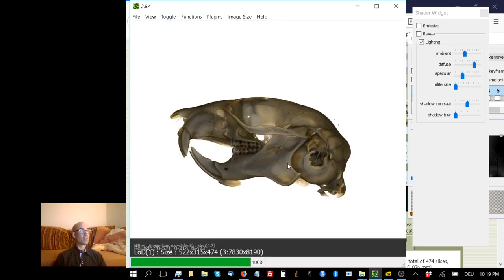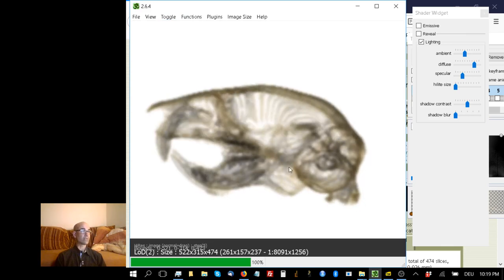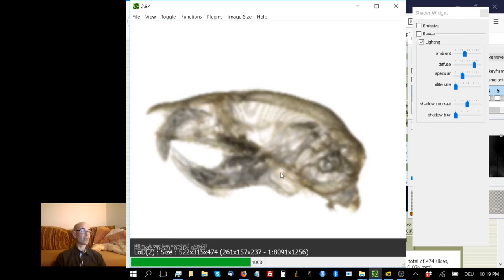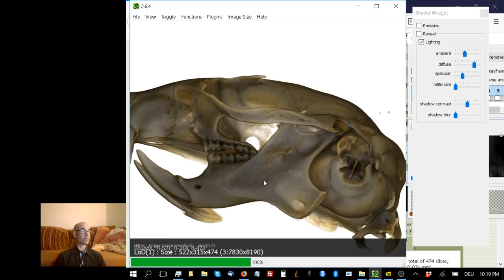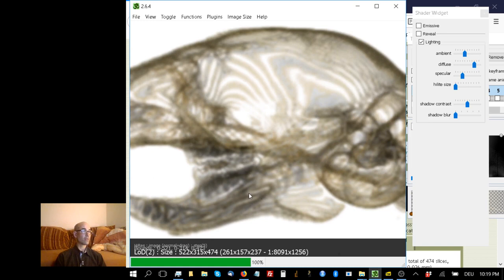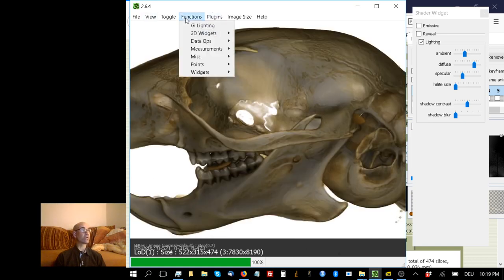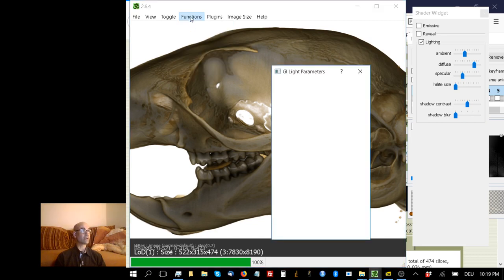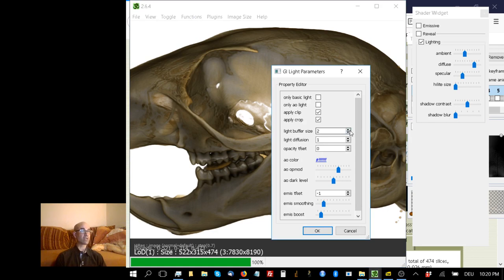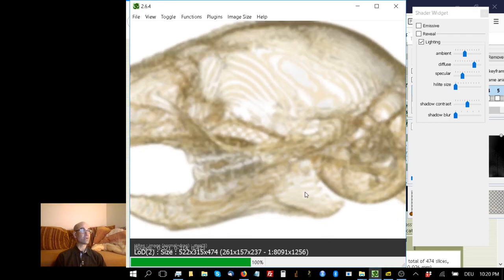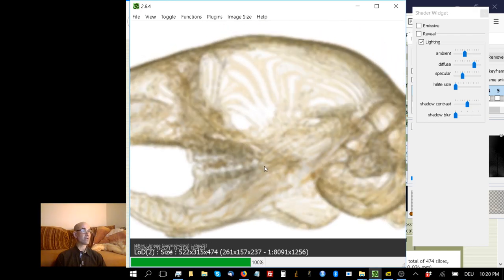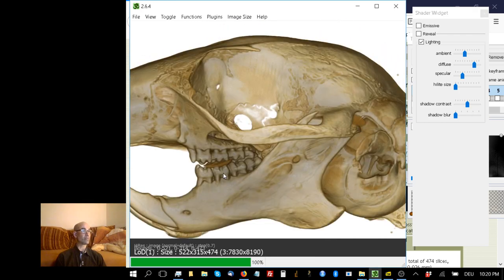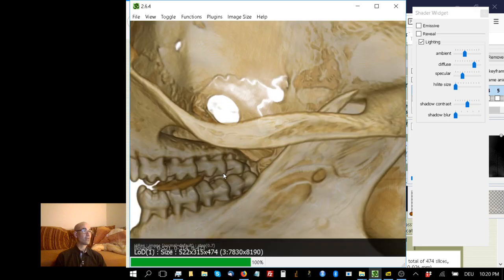Let's say I want to measure the length of one of these teeth. It's a little dark, so I'll show you another technique - GI lighting. I click on Function, GI lighting. If I increase light buffer size to seven and hit okay, it gets quite a bit brighter. That way I can see the teeth better. I'll just measure that lower fourth premolar.